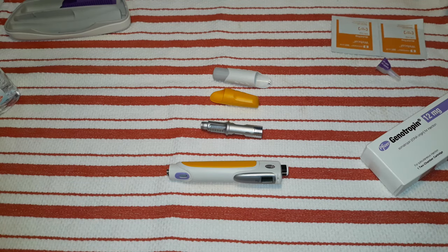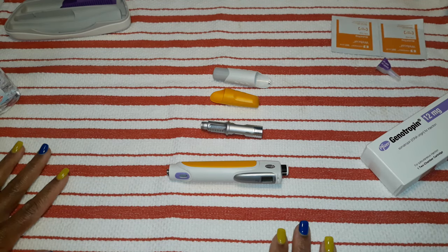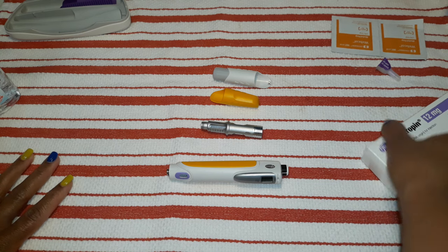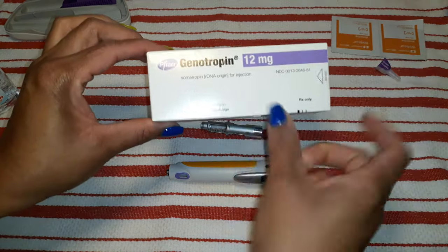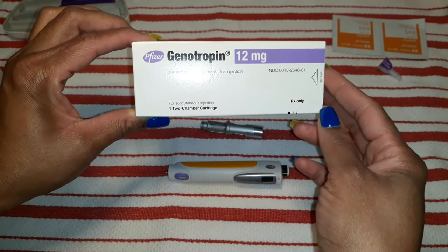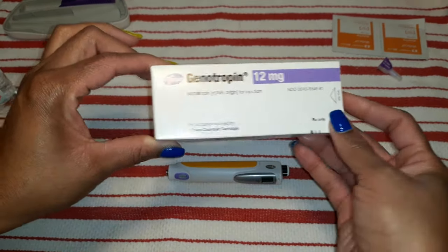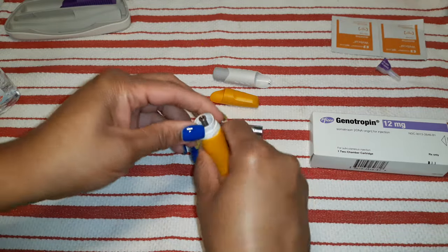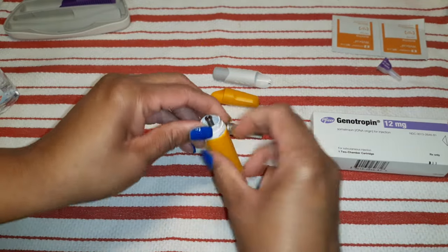Hi everyone and welcome back to the McCrazies. I have a daughter that has to get a growth hormone shot, and that is the Genotropin. It comes in a box like this. There's a pen that comes with it, and you can change the casing here.